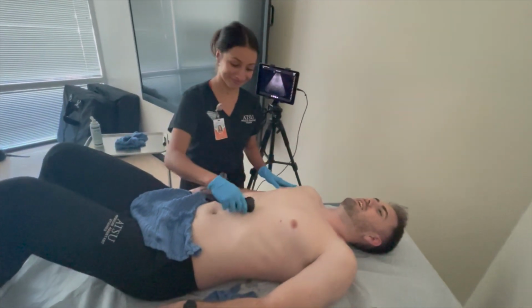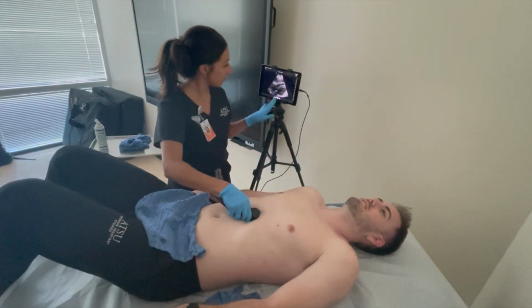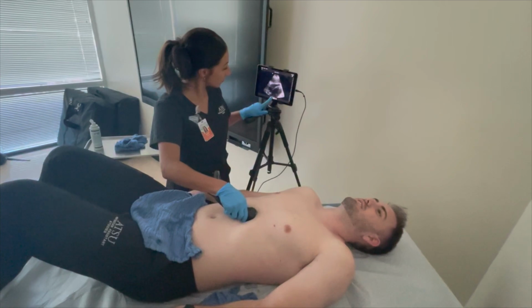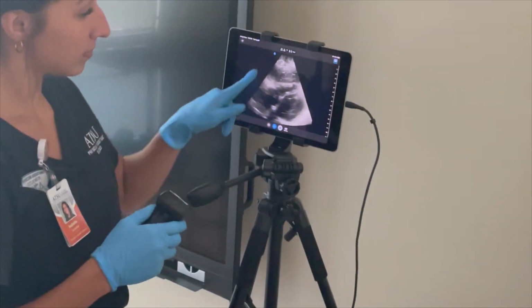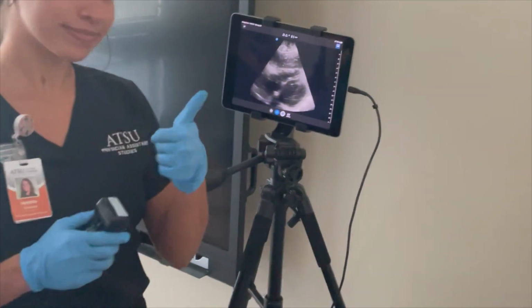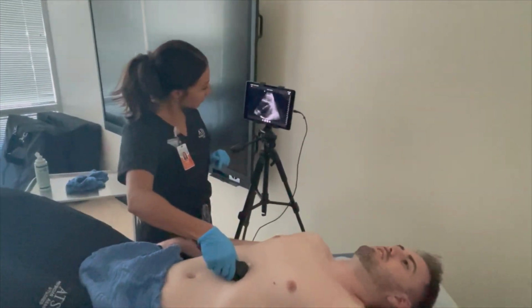When the patient exhales, press the probe into the patient's abdomen and tilt the tail of the probe towards the patient's feet, aiming the beam towards the patient's left shoulder. Here you can identify the pericardium, right atrium, right ventricle, left atrium, and left ventricle. And lastly, you can also evaluate for pericardial fluid.